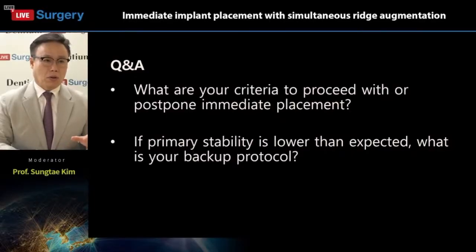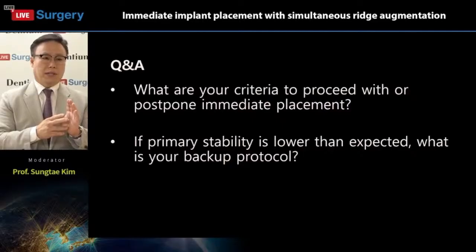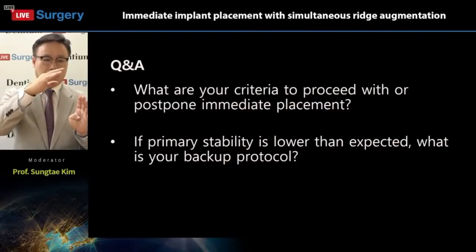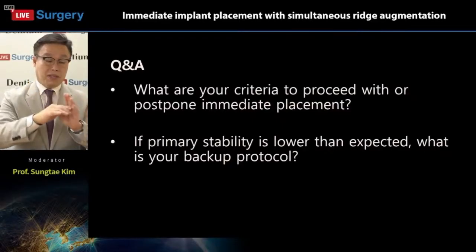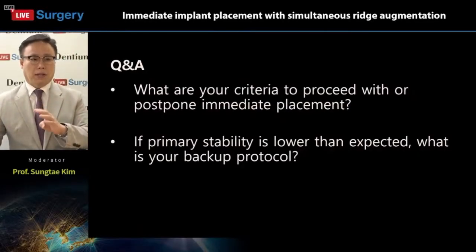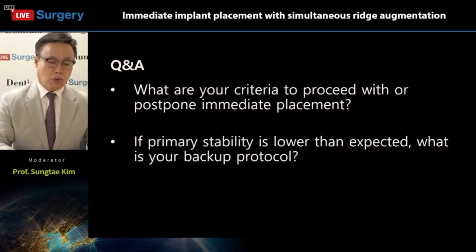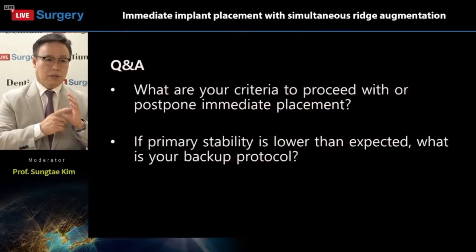It depends on the defect size. If the defect size after placing the implant is too big, I think it's better to postpone the implant. Sometimes we need a staged approach with the bone graft. Then we place the implant later. It'll be better for making a more aesthetically pleasing implant. The first one is defect size.